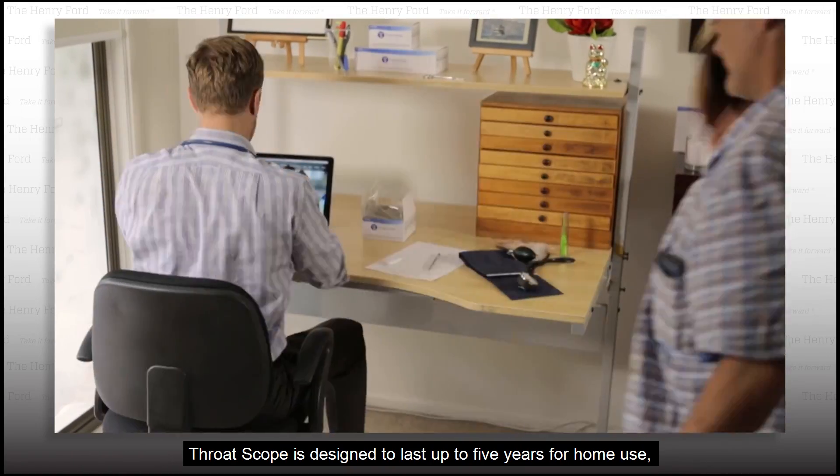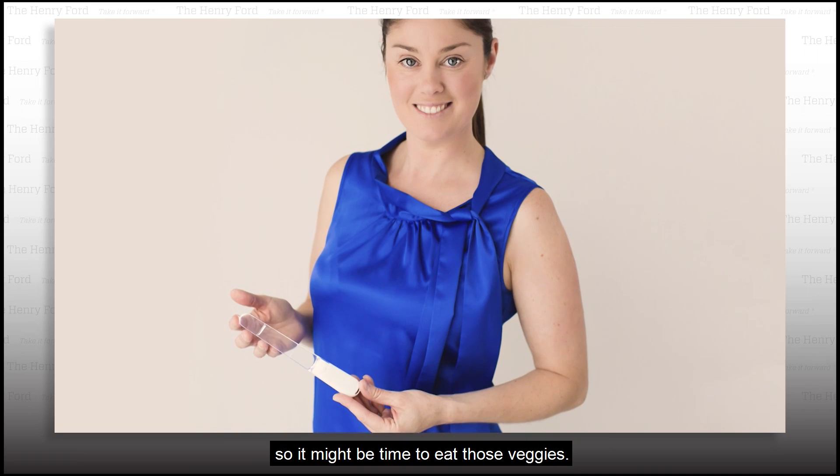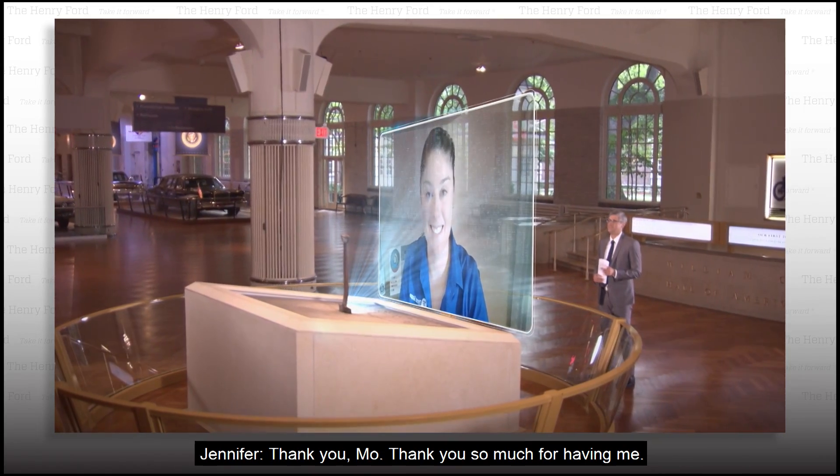Throat Scope is designed to last up to five years for home use, so it might be time to eat those veggies. Jennifer, thank you for being on our show. Thank you so much for having me.